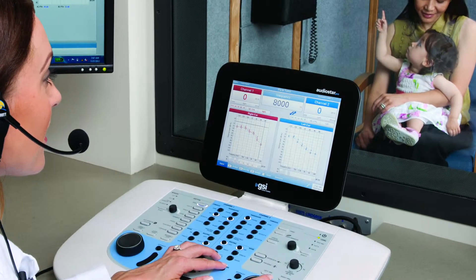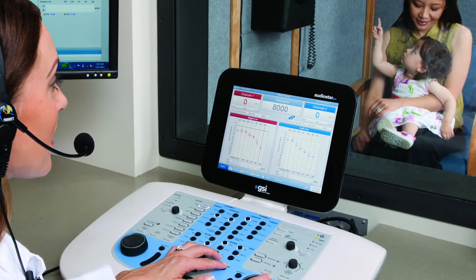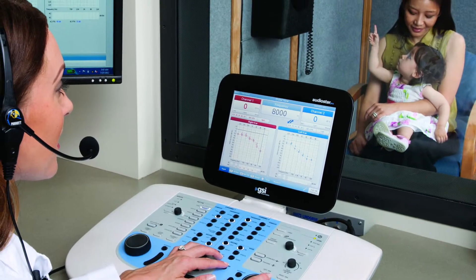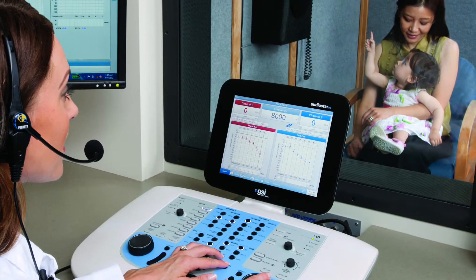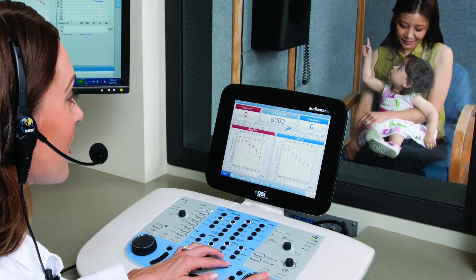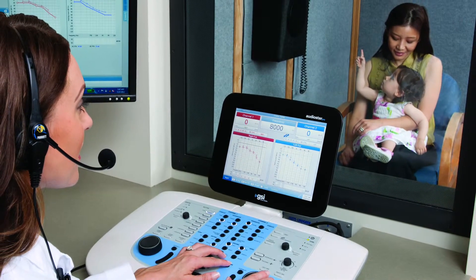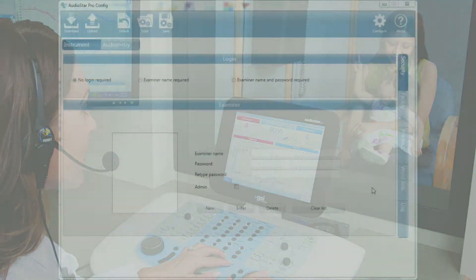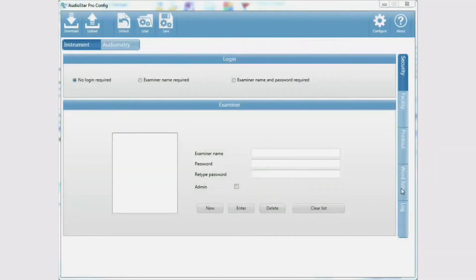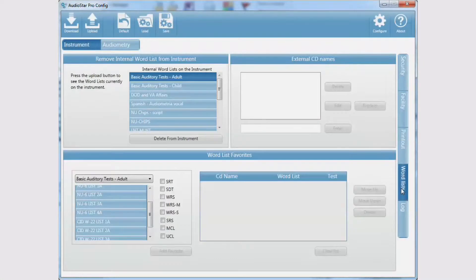With the AudioStar Pro connected to the PC, open the configuration application and select Upload. Click on the Word Lists tab to see all the internal word lists on the audiometer.